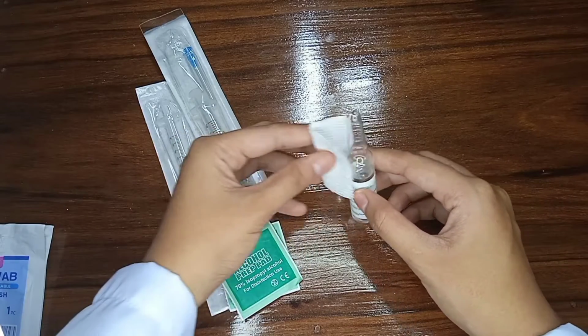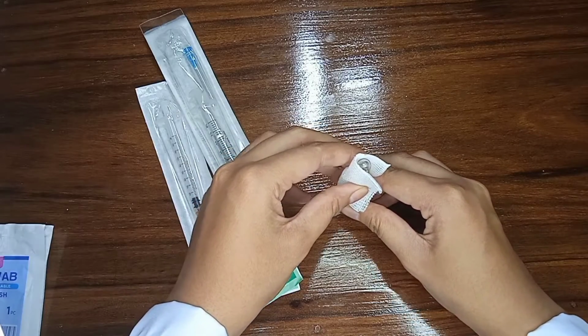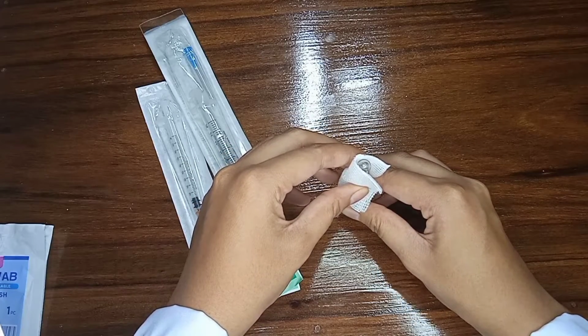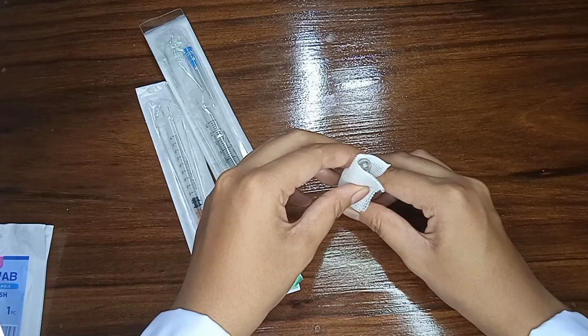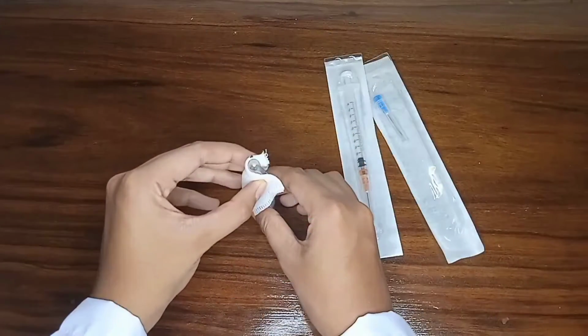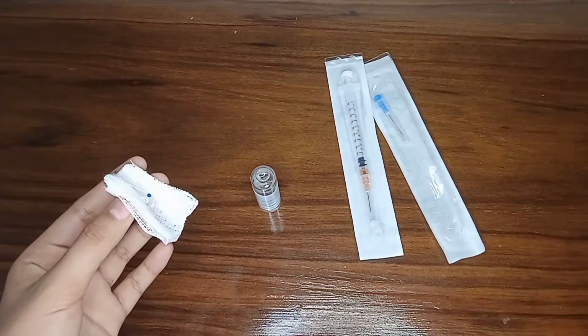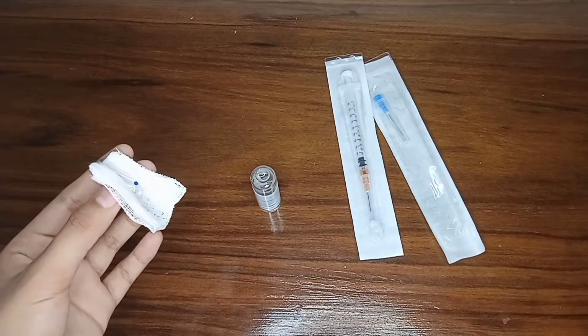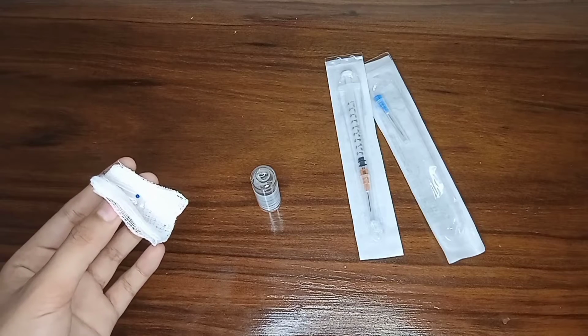Here's the neck. And then we are going to break off the top by bending it toward us to ensure the ampule is broken away from ourselves and away from others. After breaking off the top of the ampule, we are now going to dispose the top of the ampule in the sharps container.